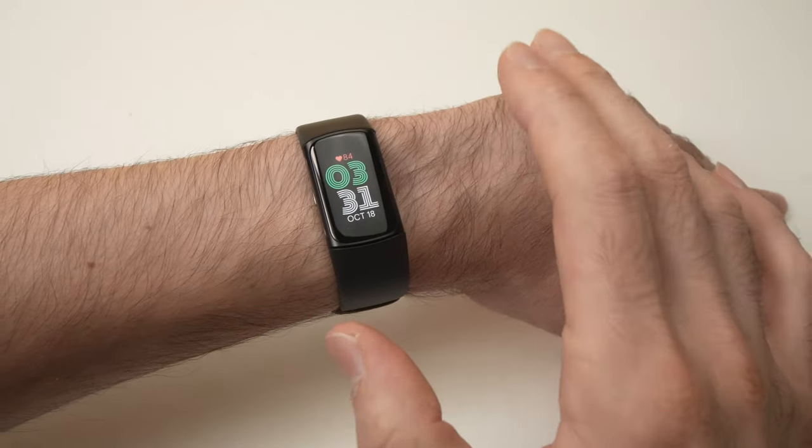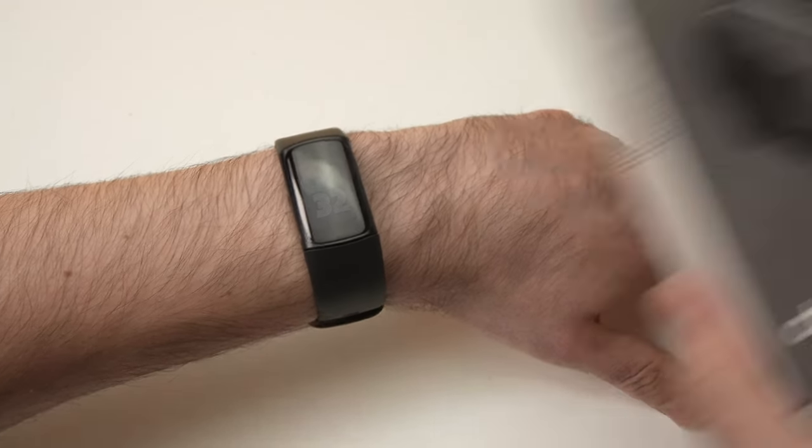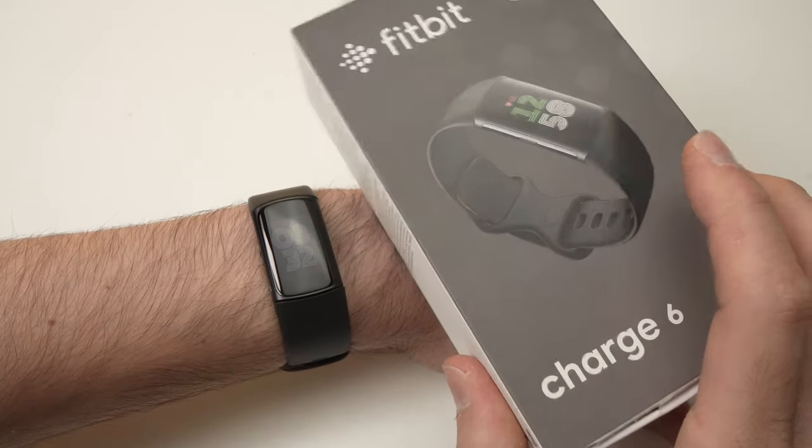In this video I'll show you how to use the ECG function of your Fitbit Charge 6. Let's get started.